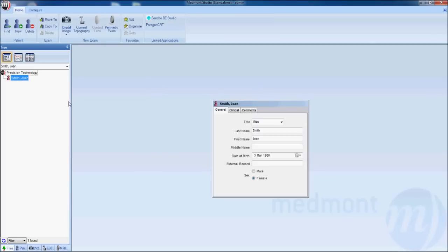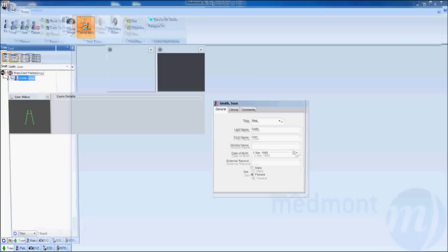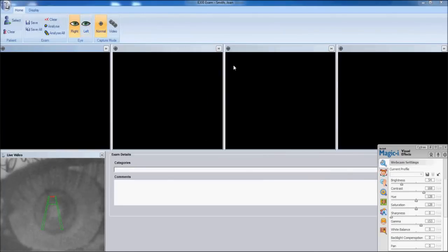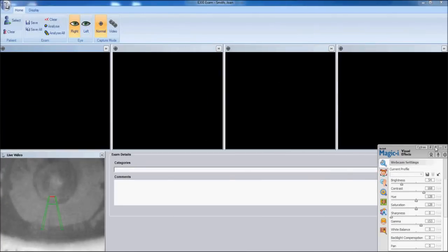You'll notice that the patient has been created on the left hand side. With that patient name highlighted you're ready to capture topography. You can go up to the new exam and corneal topography. This will bring up your capture window.